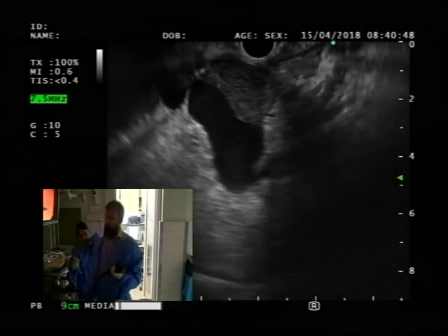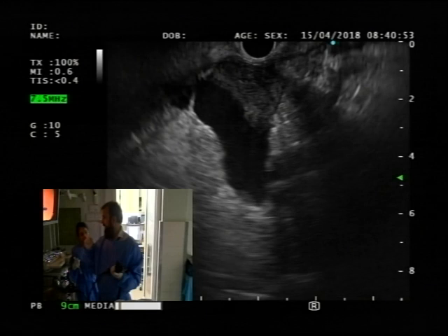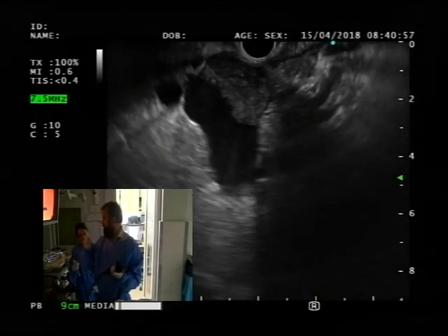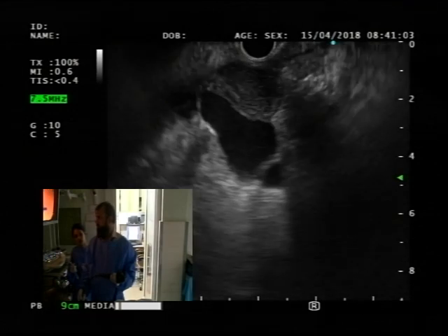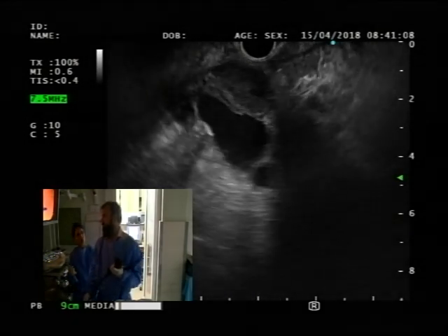And चलो देख लेते हैं. If tissue, it must be a tumor with a thrombus, yeah. But it's in the vessel, no question about that. How can you have tumor with no... Maybe from somewhere else. Okay. And her clinical picture, yeah, it's not.